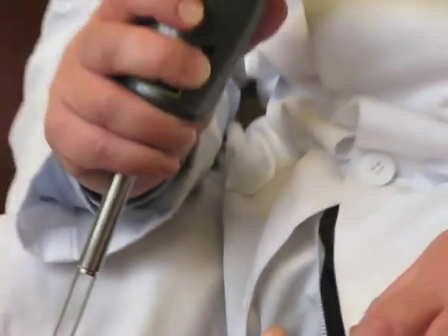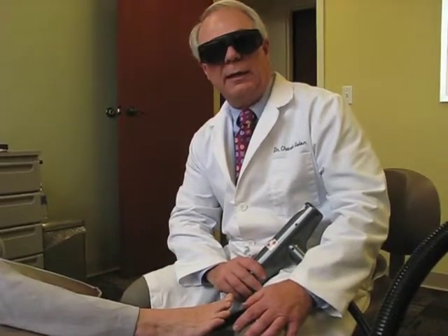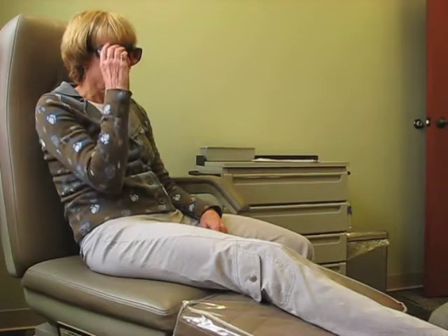So we've treated Wendy's toenail. She'll leave here and come back in about four months, and we'll check her nail. At that time, we expect to see a normal appearing healthy nail replacing the old nail.